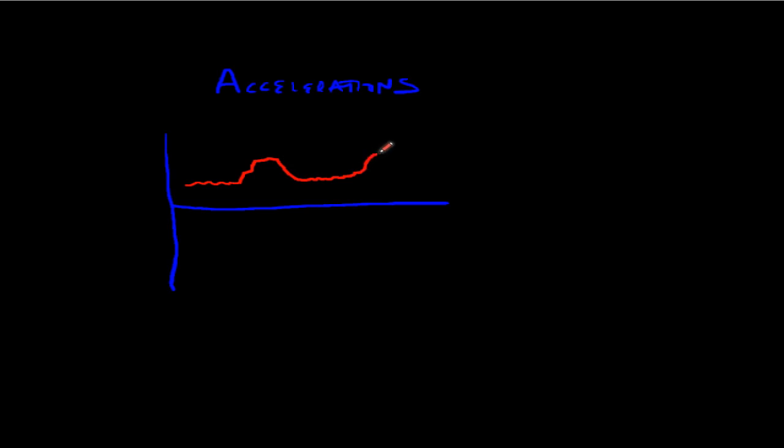We also want to look at accelerations. And again, accelerations are abrupt increases in the baseline. So things that go up.